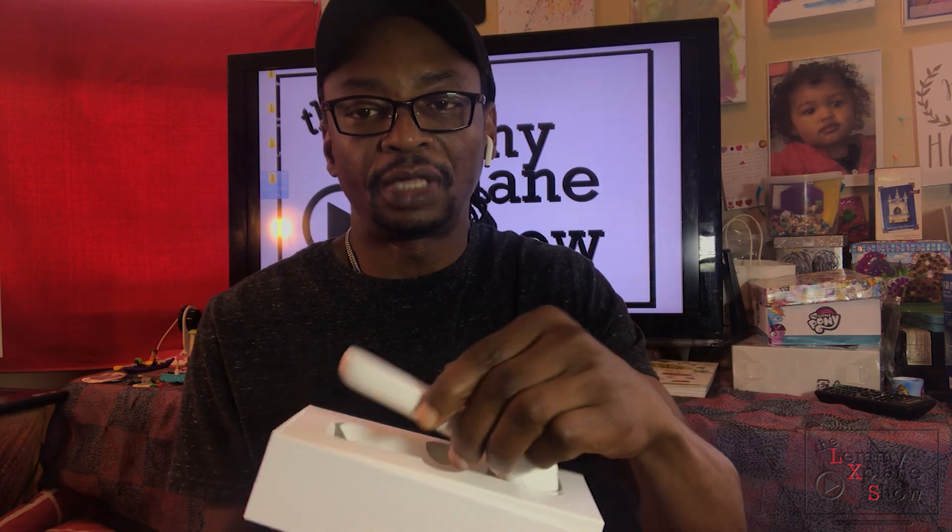So far I love the packaging. Let me just adjust my camera so you can see the packaging. The packaging is pretty classy — I like it. It's an easy-to-open box.